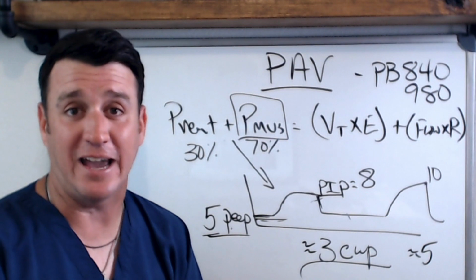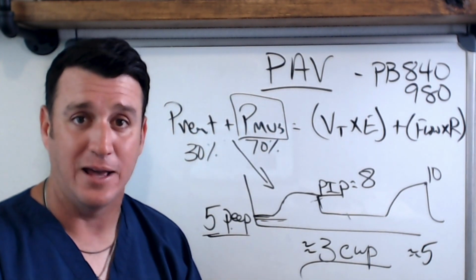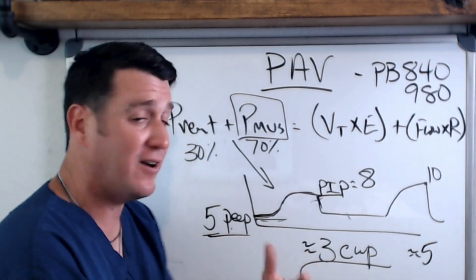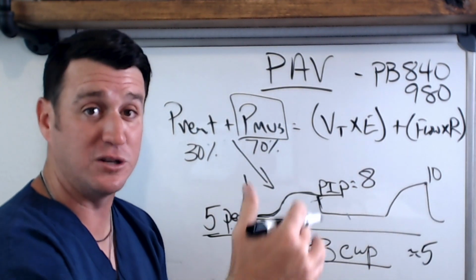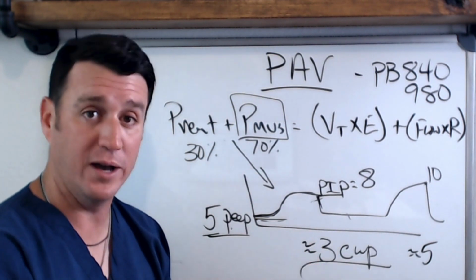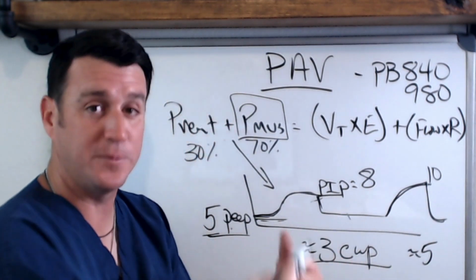But as an educator, I can wrap my brain around it and say, I can see how people think that, because the inspiratory pressure will vary based off of the work of breathing. Remember, I told you that if the work of breathing increases, then the vent support will increase proportional to the patient? Well, it will do so by increasing inspiratory support.